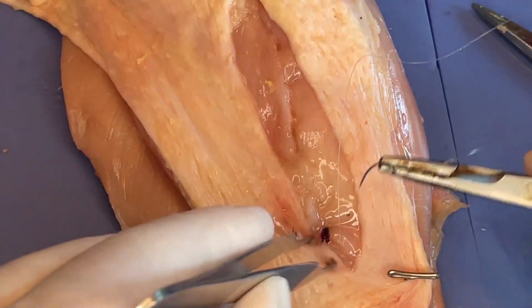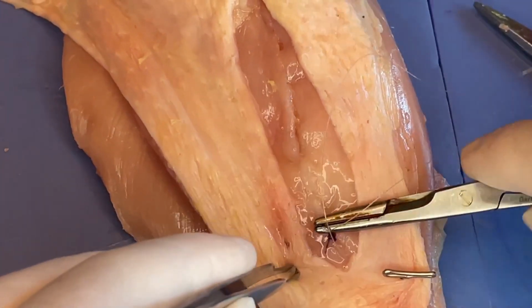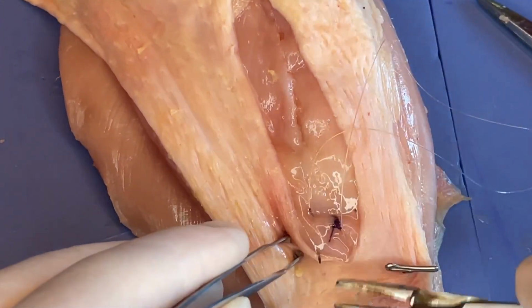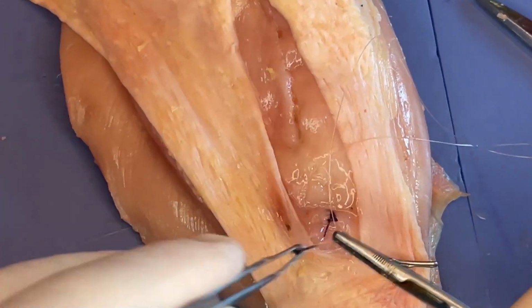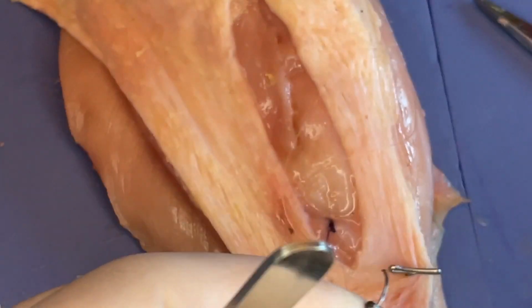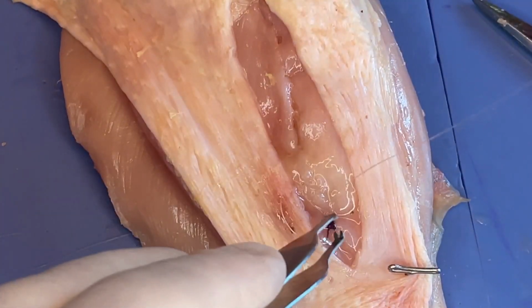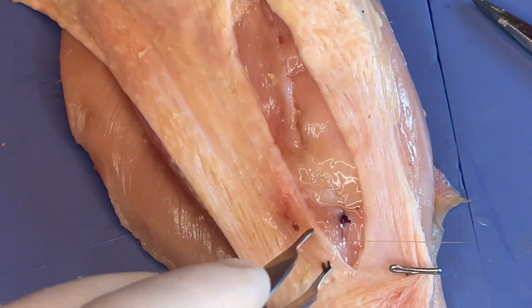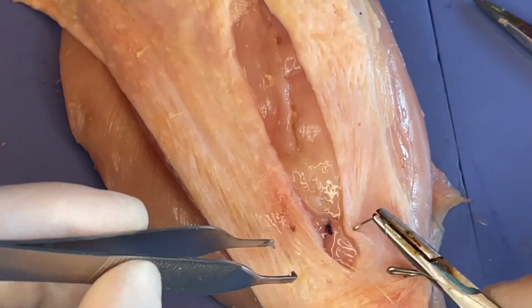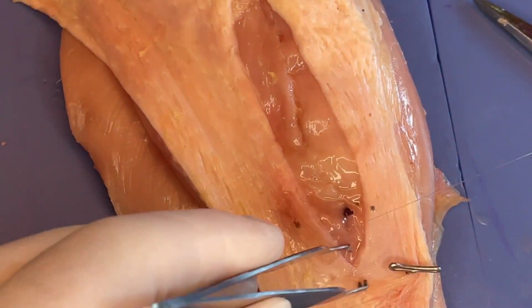And one more kind of there. This is just kind of going through the tissue. We're a little bit beyond where we had really created that defect, since our skin edge is being a little bit tricky. All right, so let's say that we had, I'm just going to do a quick little bite there.